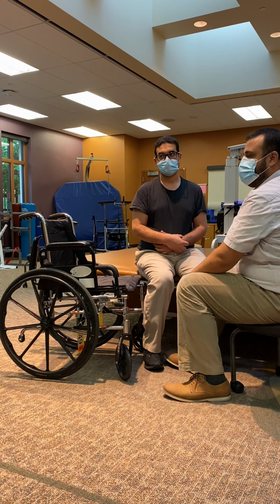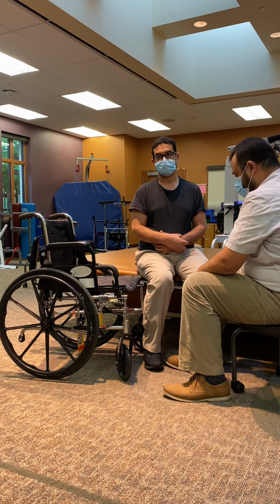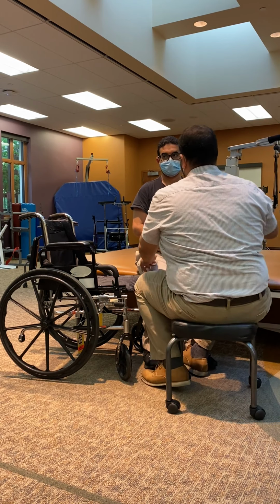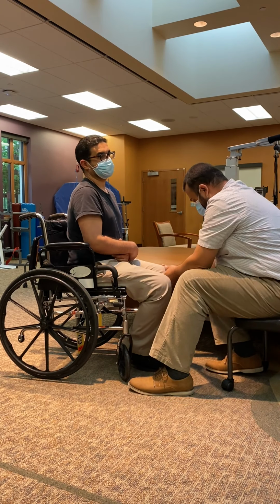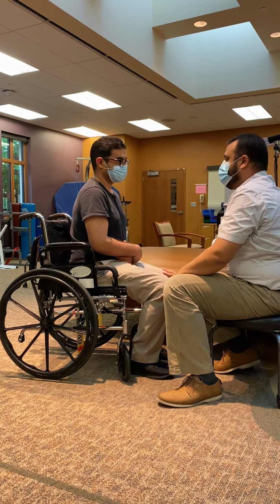I'm not going to block his knee all the way. I'm going to keep my knee only for safety. In case he buckles, I can just lock his knee. So lean over to my shoulder, please. 1, 2, and 3. And swivel. Good job. That was well done. So now I'm going to show the video from behind so you can see my hand placement.